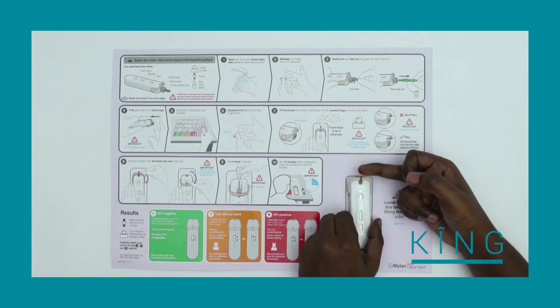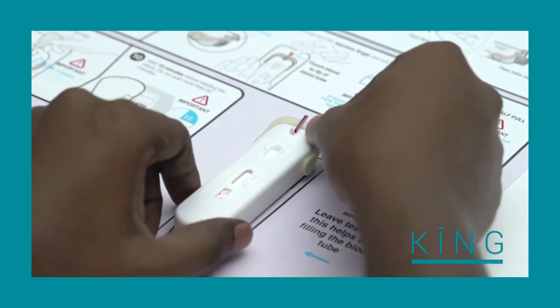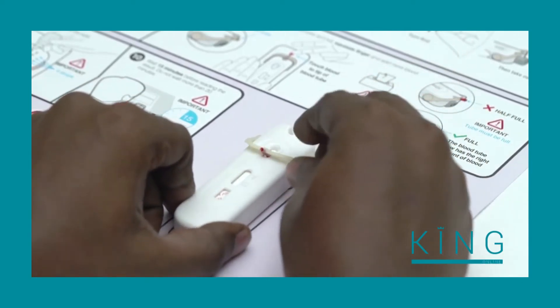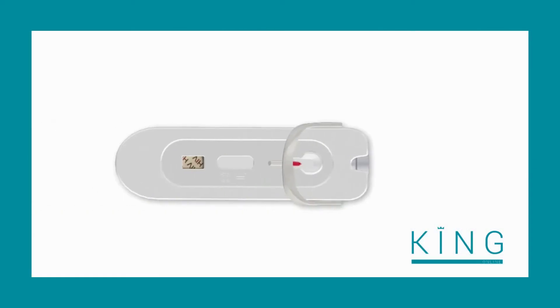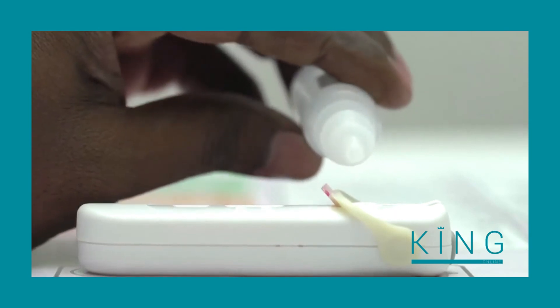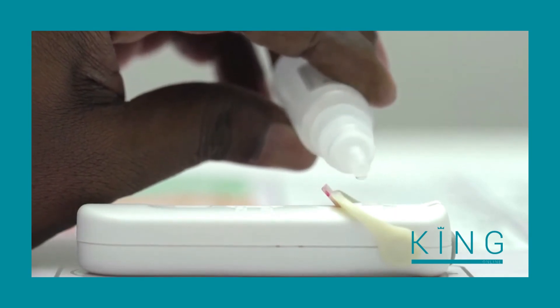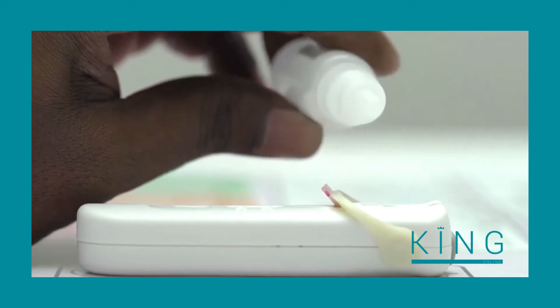It is important that the tube is full — repeat until it is full to ensure the test has the correct amount of blood. Hold the test on the table and flip the tube over using its support arm until it stops. Check to make sure the blood has moved from the tube into the well. Now add four drops of test fluid into the well on top of the blood: one, two, three, four.